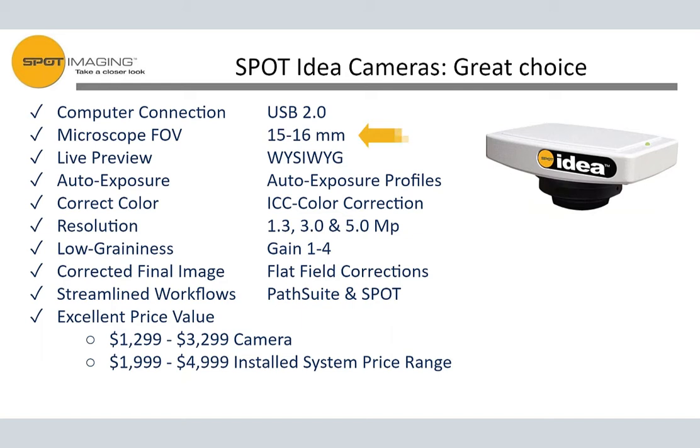Second thing is the microscope field of view. Generally, the optical adapters provide you with a 15 to 16 millimeter diagonal field of view, and you should note that your eyepieces are typically providing you a 21 to 23 millimeter diagonal. The live preview on this is what you see is what you get, so we check that box.